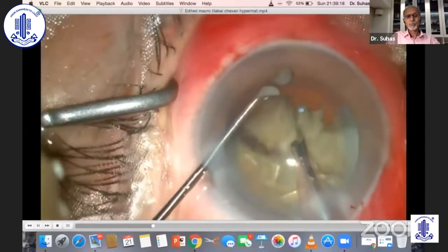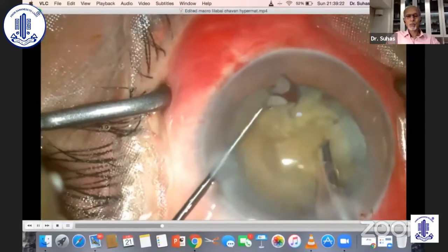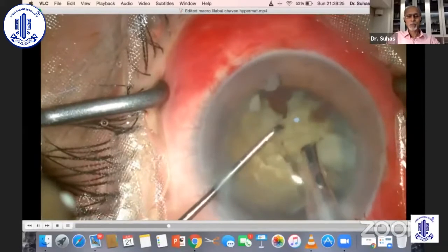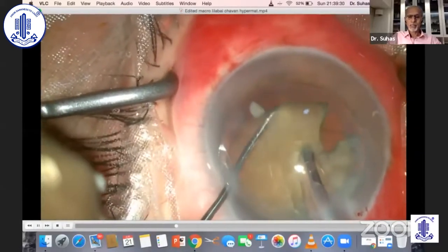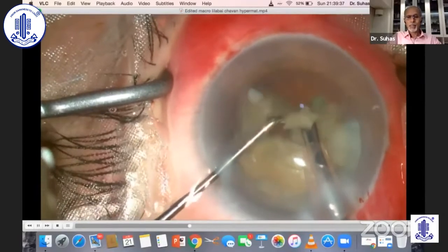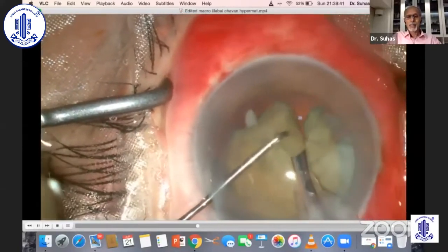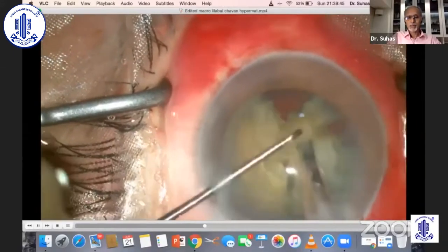I could literally see the posterior capsule jumping into my phaco tip. At some stage I had to take a call — I thought, why not do something else where my phaco is a little more comfortable than the way I was doing it at this stage? So I just thought of scaffolding.